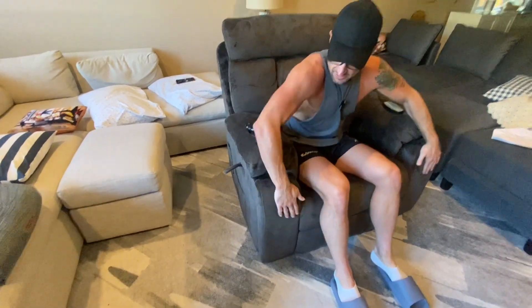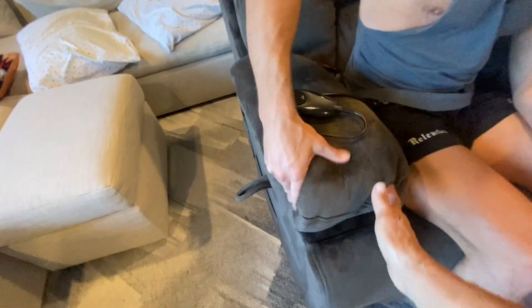First thing I want to say is it's extremely comfortable. I can't believe the number I see on the product page. I cannot believe how comfortable this thing is — touch it, it's like a really nice comfortable material.